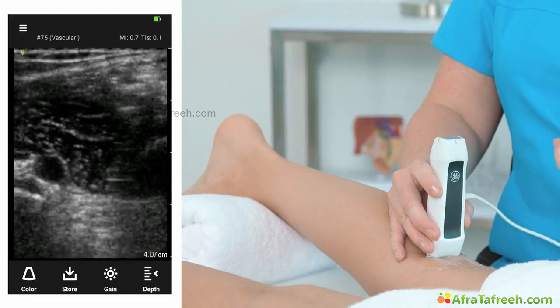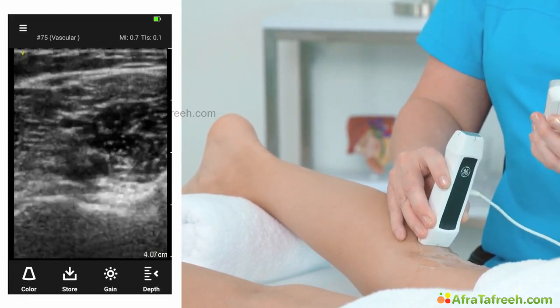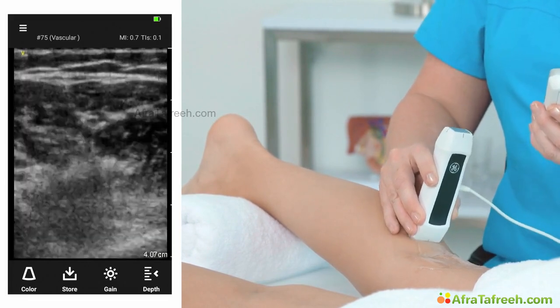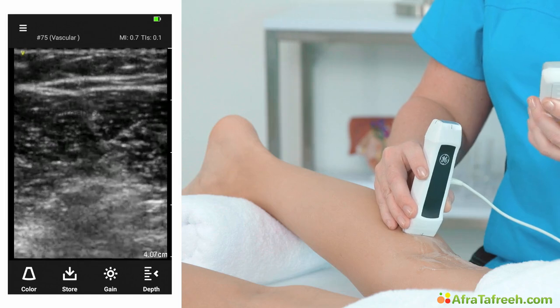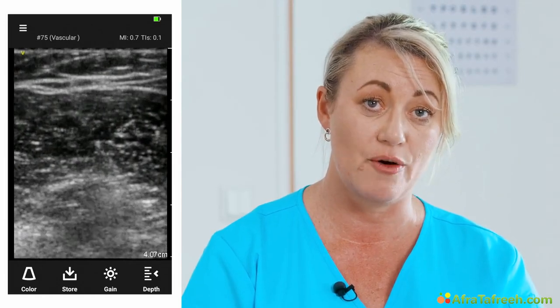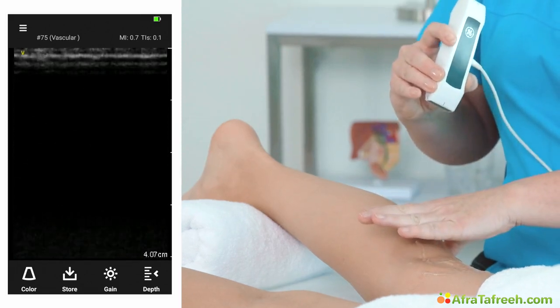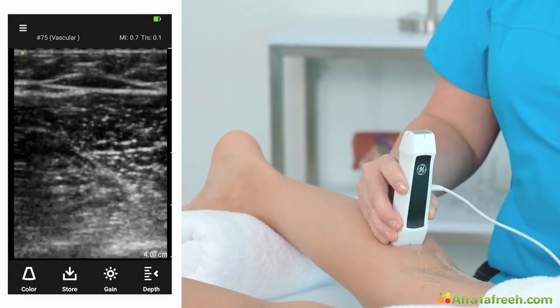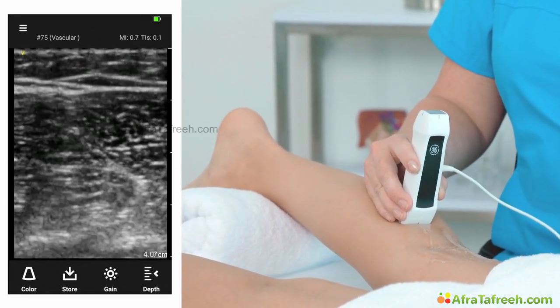Coming back to the knee crease, we can now continue down the leg, compressing as we go until we no longer see clearly the popliteal vein. We know that this is about the level of the tibio-peroneal trunk where the small calf veins start to branch off. And again, you can try using the handspan below the knee crease as a guide to how far down you can see those vessels well from the posterior approach.